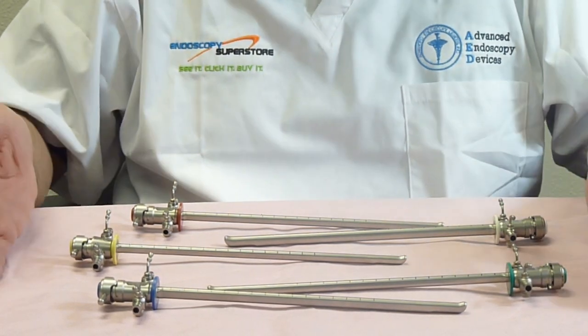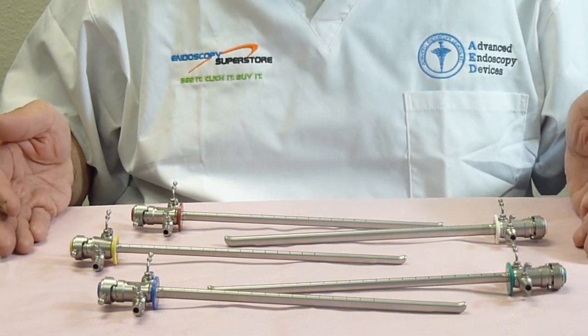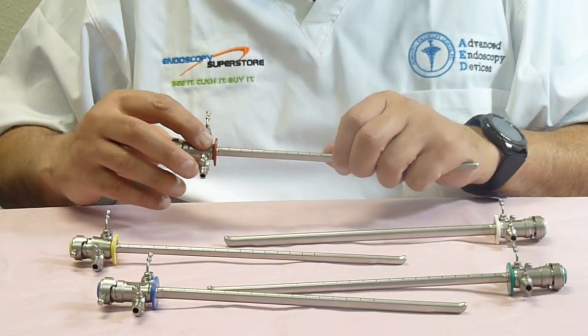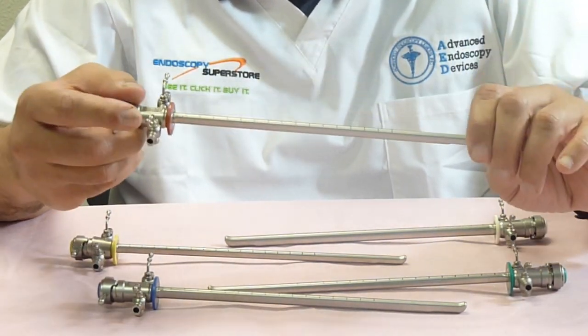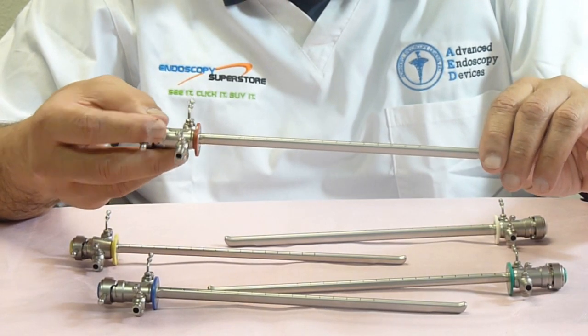I will start off with our rigid cystoscope sheaths. We have them available in five different sizes, and each sheath is color-coded based on what size it is — the standard color-coding that's used in the industry. All our sheaths are made of 100% stainless steel, and the sheaths are manufactured in Germany.